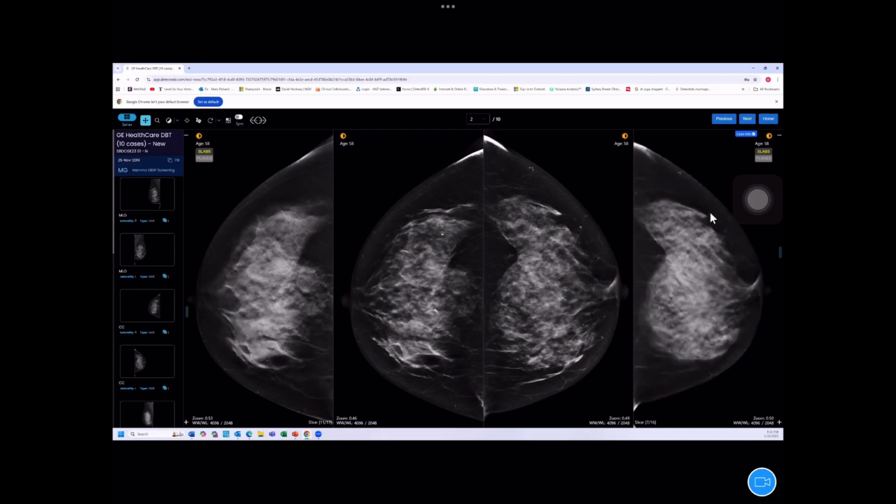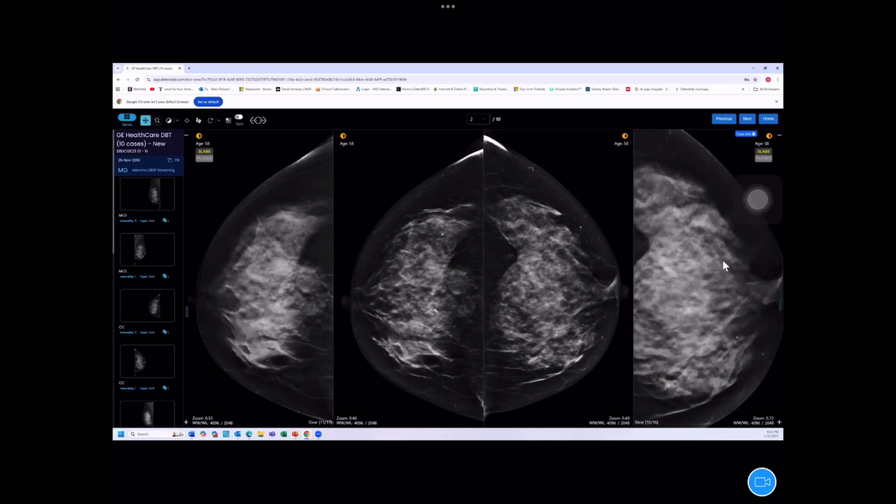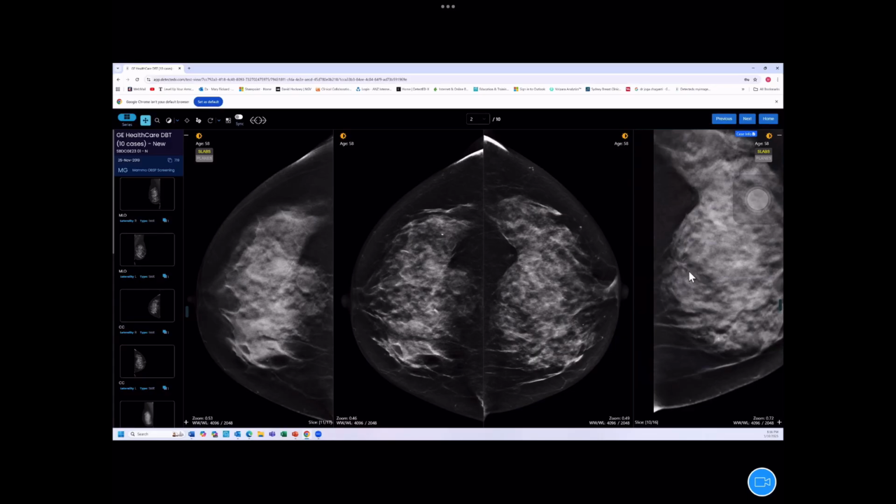So we'll come back to this side, and I'll scroll slowly through this particular slab of images, and I'll stop here. Can you see the abnormality? So here's the abnormality, isn't it? As you come along, the contour is broken by an area that we can see is clearly spiculated. No? Really, a little spiculated lesion in this area.